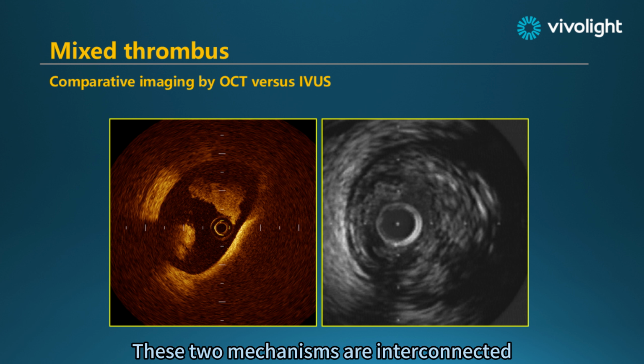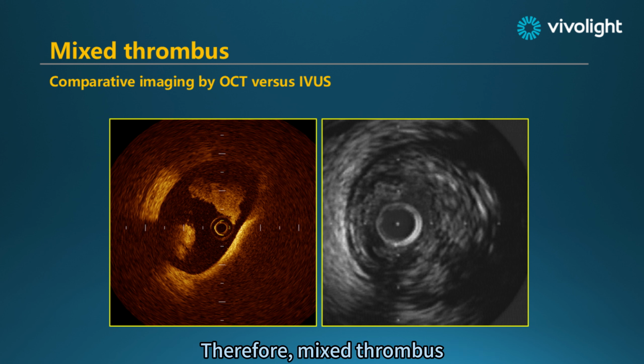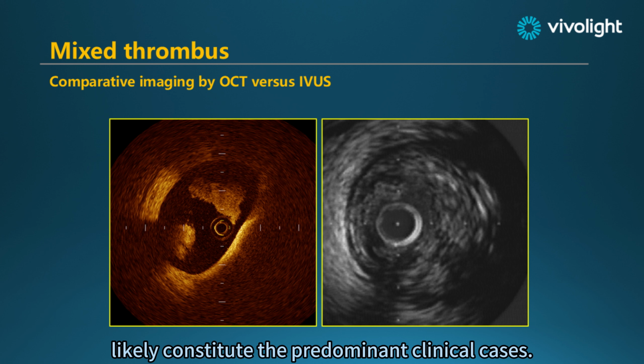These two mechanisms are interconnected, rather than entirely two distinct processes. Therefore, mixed thrombus likely constitute the predominant clinical cases.